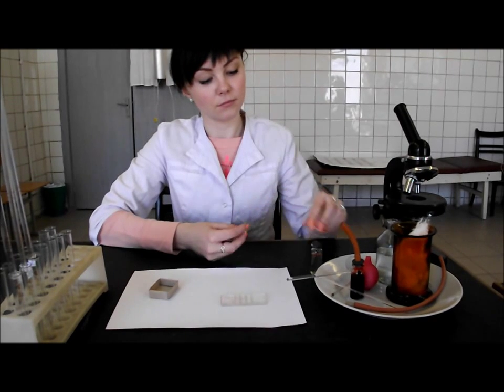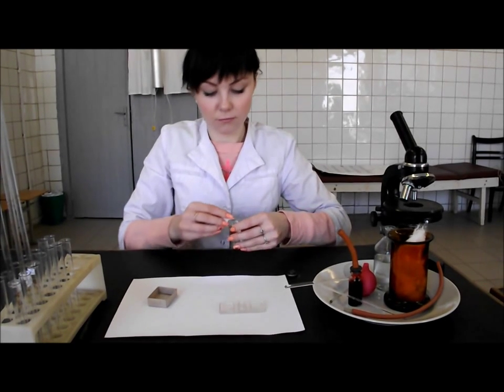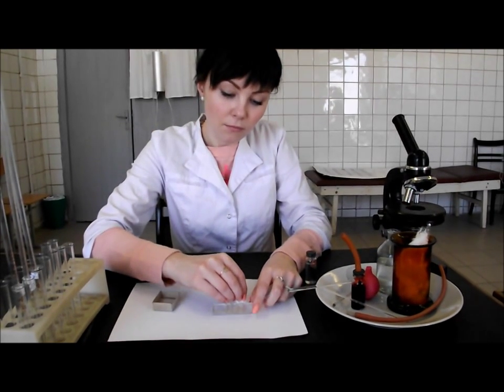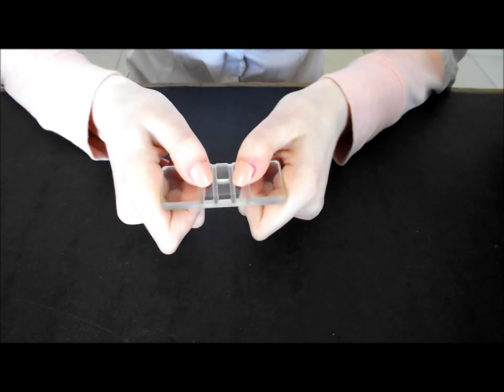At first, clean the chamber and the covering glass with cotton wool moistened with alcohol. Dry them. Put the covering glass on the center of the chamber. With the help of thumbs, move the covering glass back and forth until the appearance of the colorful rings of Newton. Leave the prepared chamber on the table.